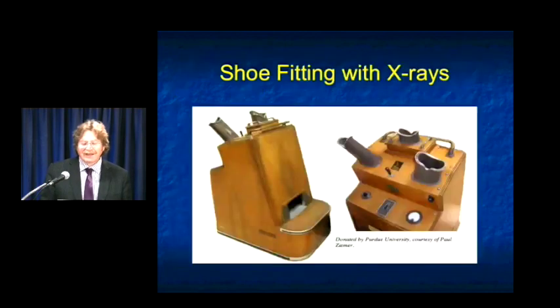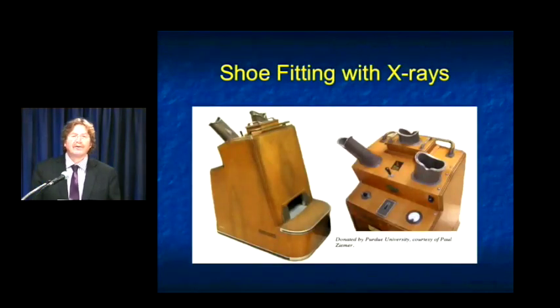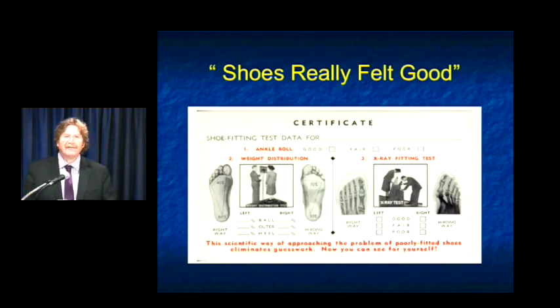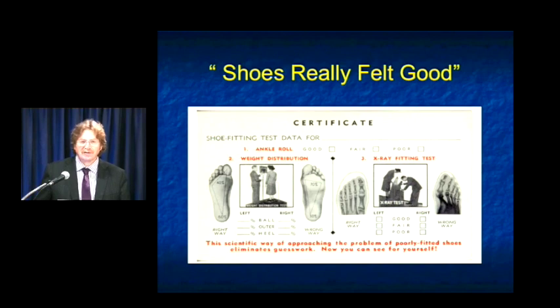Now, one thing I need to at least bring up, and I won't go into great detail, will be radiation dose. And radiation has been the big focus of CT for about a decade now. The history of X-rays is a long history. In the 30s and 40s, we were shoe fitting. Not that radiologists were doing that, but people were getting their feet X-rayed to get better shoe size. And some people swear their shoes never fit as well ever since things changed.